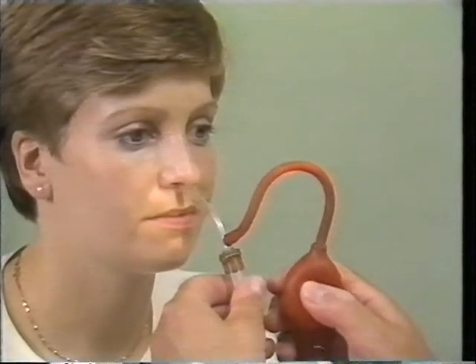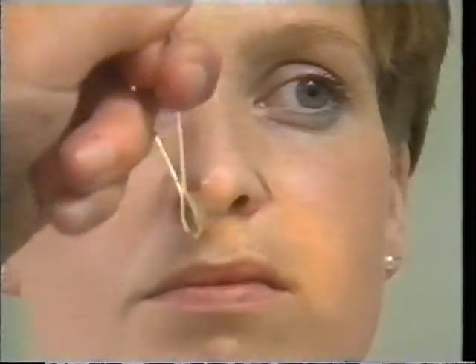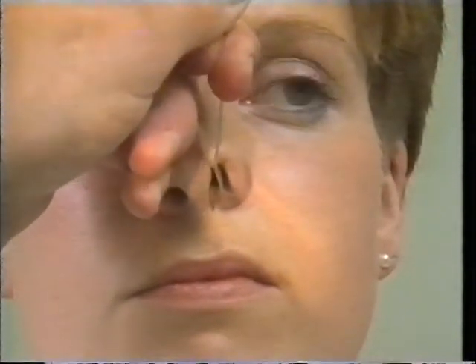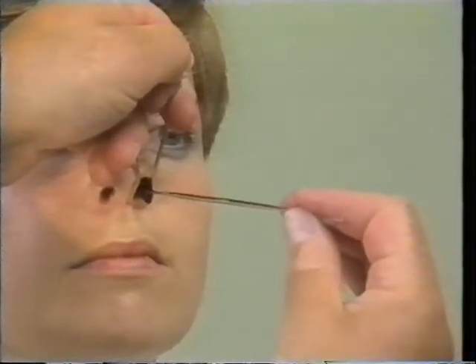A deviated nasal septum may be recognizable from the exterior of the nose. The examination may be assisted by spraying dilute cocaine solution into the nose and observing the degree to which the mucosa constricts. The speculum is then inserted to examine the interior. We can see here the septum, the inferior turbinate as a bulge, and the middle turbinate. The local anesthetic effect of the cocaine solution allows palpation of the mucosa to distinguish between freely mobile polyps and more firmly attached mucosa.